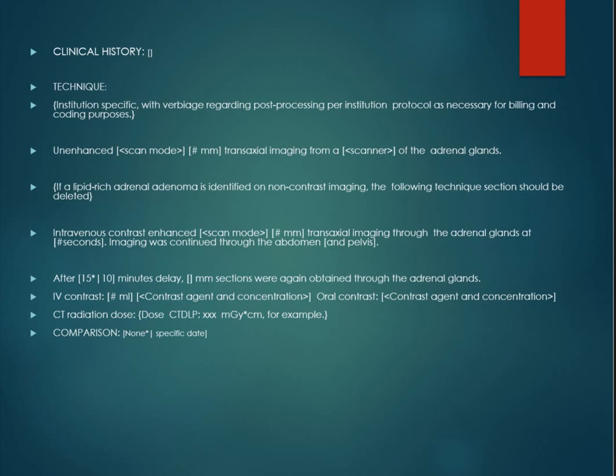this following part should be deleted. For example, intravenous contrast scan, transaxial images through the adrenal glands, and this timing imaging was continued through the abdomen and pelvis, may or may not. After this time delay, we did the same image on the adrenal gland. The amount of IV contrast used, the name and the concentration of the IV contrast, and oral contrast, if it was used or not. CT radiation dose should be reported, and comparison was done with the previous image done on this date.